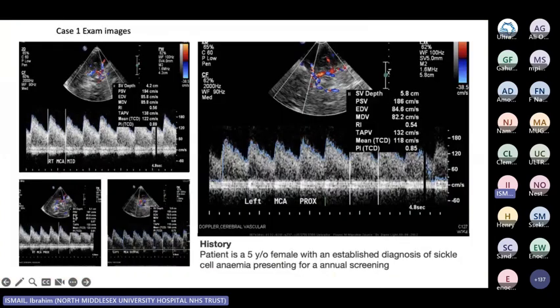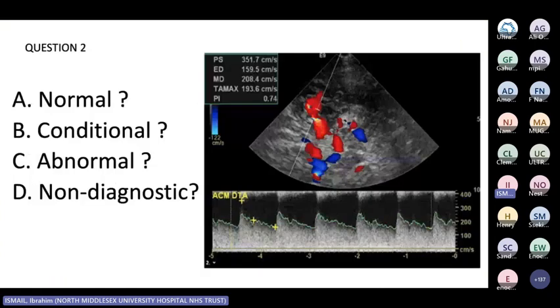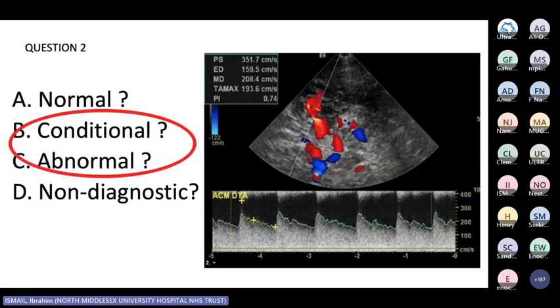Even though I would schedule an examination between 6 to 8 weeks, I would also mention that the close proximity to abnormal is a cause of concern. So in summary, it is conditional. However, you have to be wary of how high the conditional value is and how close it is to abnormal. So I would usually almost tailor the follow-up to the patient considering how close it is to 200.